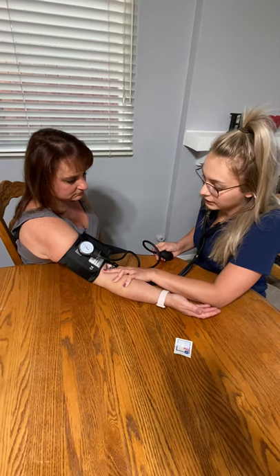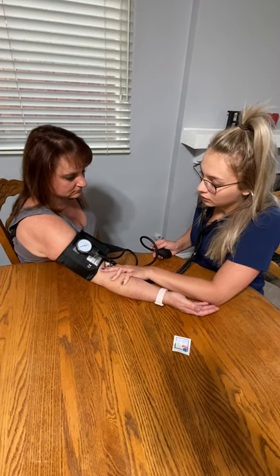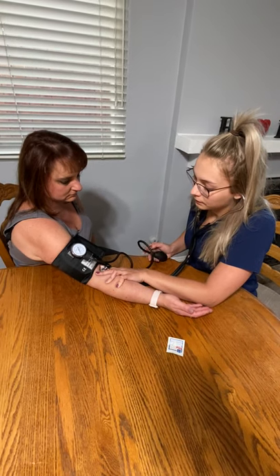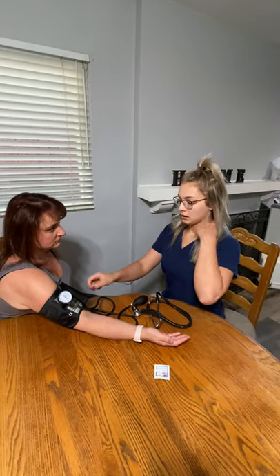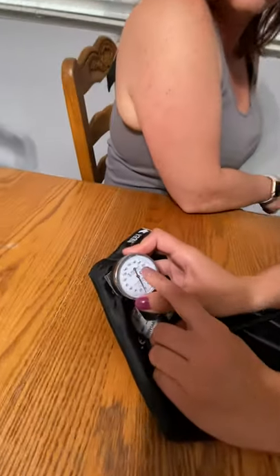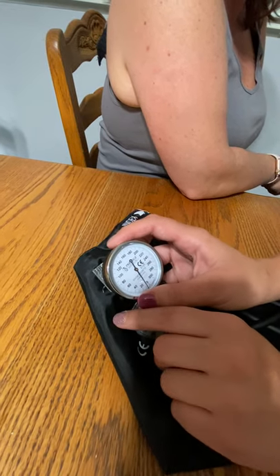I'm going to slowly release. Because of privacy reasons and HIPAA, you are not allowed to say the blood pressure out loud. Right after you're done, you're not going to say anything — you're going to go and record it. A lot of students watch the arrow bounce and think that's the reading, but sometimes the arrow bounces before it actually starts thudding, so you really have to listen for that first noise.